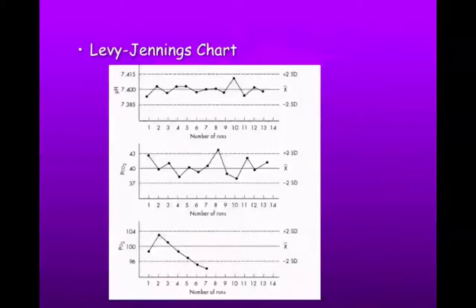The moment it becomes out of control, or if you see this trending too out of control, you need to figure out what's going on and not run any more blood gases on that particular machine until you've addressed it. You know, blood gas machines have a lot of maintenance, especially the older ones. They have little membranes that dry out or various things that can occur that you may have to readdress. Fortunately, the newer machines have these cartridges that have all these pieces in them that typically don't dry out because you pull it out, say, every 30 days or whatever and dispose of it. And so that maintenance is much better, a lot less work for the RT today.